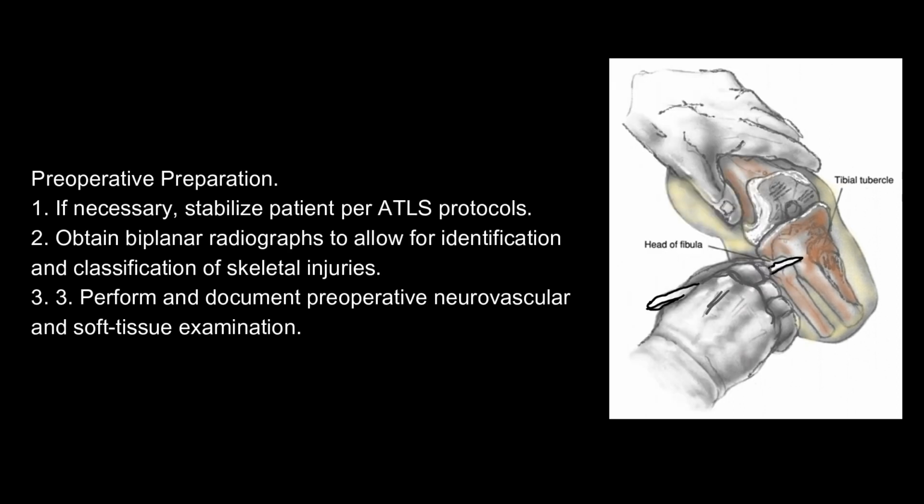Preoperative preparation. 1. If necessary, stabilize patient per ATLS protocols. 2. Obtain biplanar radiographs to allow for identification and classification of skeletal injuries. 3. Perform and document preoperative neurovascular and soft tissue examination.